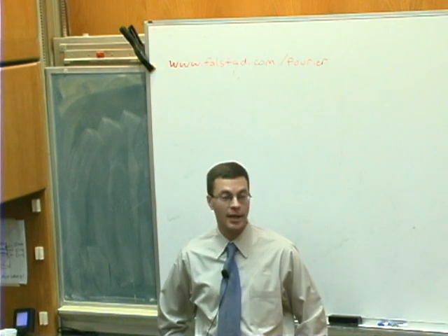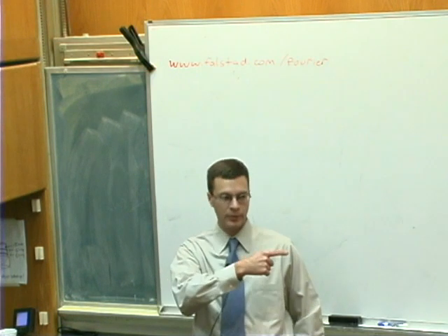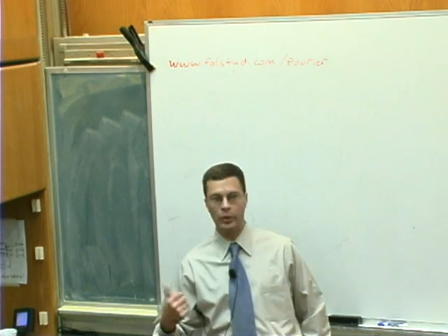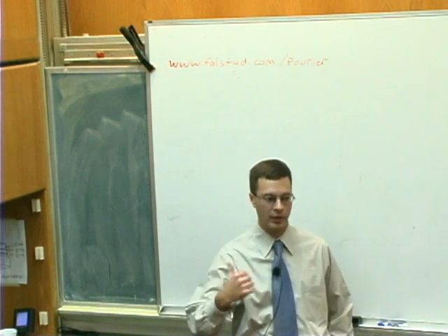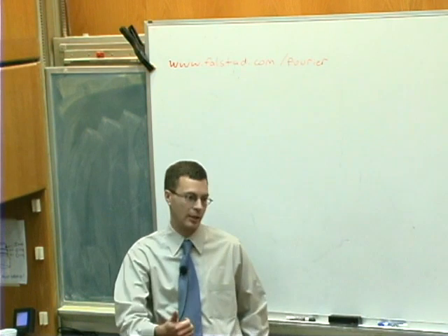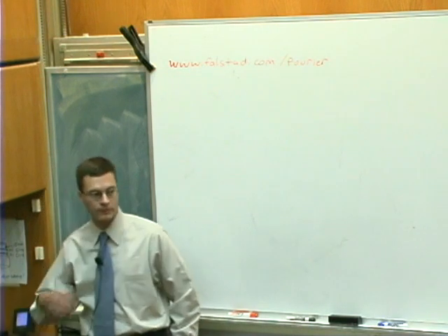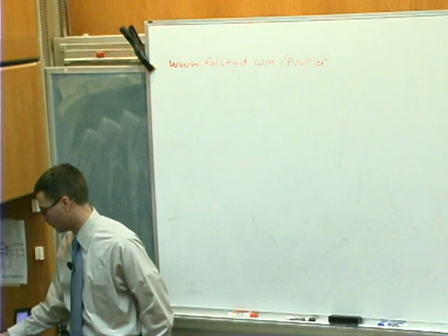In fact, the 1 over f noise that we see on our spanking new 3T Siemens machine is less than we used to see on our 1.5T GE machine. Now, whether that is signal strength, or the strength of the magnet, or because Siemens is better than GE, or because the magnet's better shielded or better shimmed, I don't know. Nobody, at least I've never seen anyone, has a credible full explanation of where 1 over f noise comes from. So I don't know yet where it would come from or how you get rid of it.